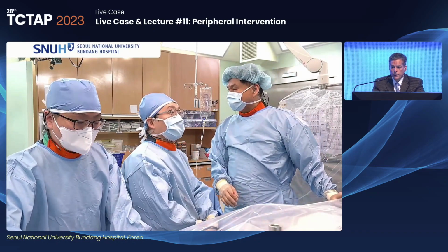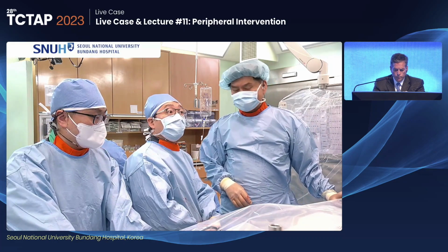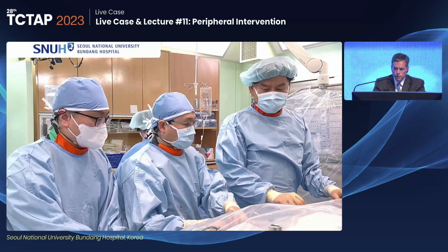Dr. Yoon, we just left you. We're going to room 2 real quick. First I'll take this out. I think post-stenting we also need IVUS, right?